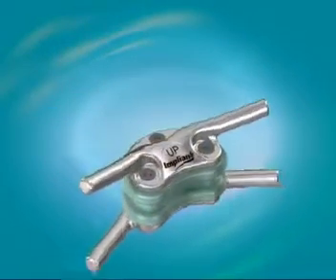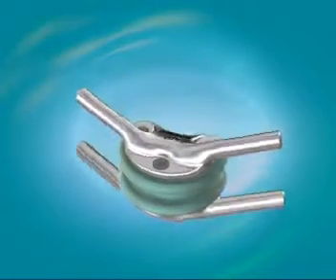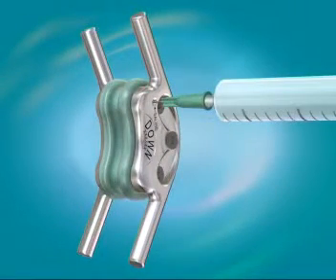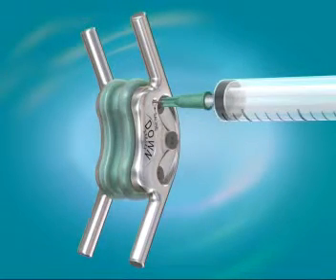Open the TOPS sterile packaging and remove the implant. Hold the implant in your hand for the filling process. To fill the TOPS, use a 5 cc syringe and a 27 gauge by 13 mm hypodermic needle. Inject 4 cc's of sterile saline into the device via the filling port.